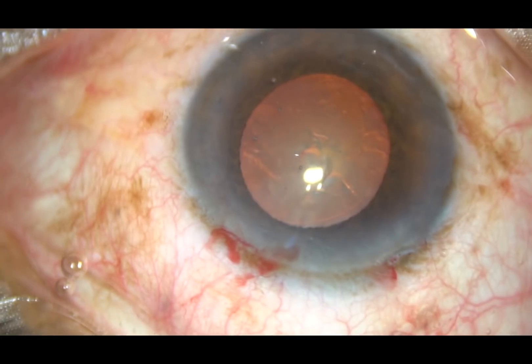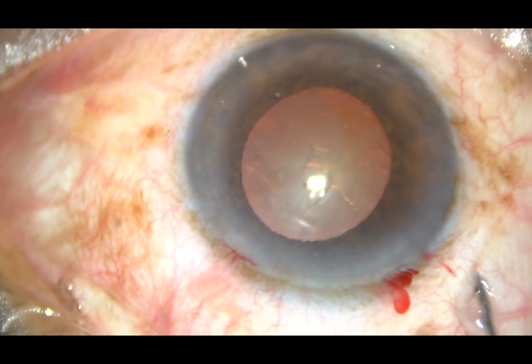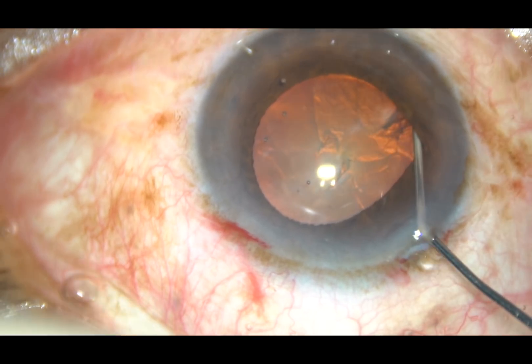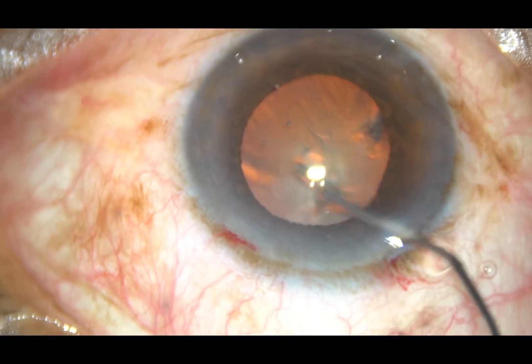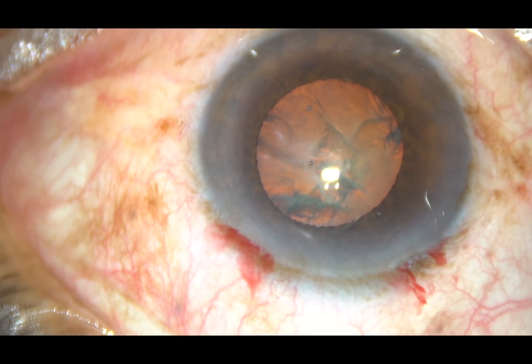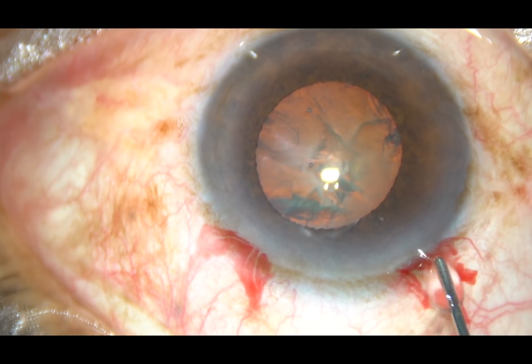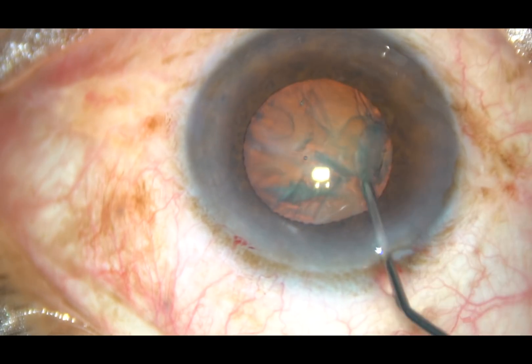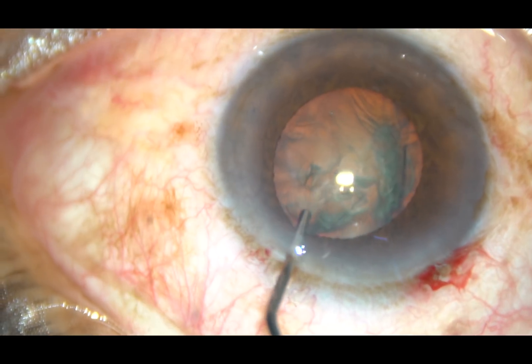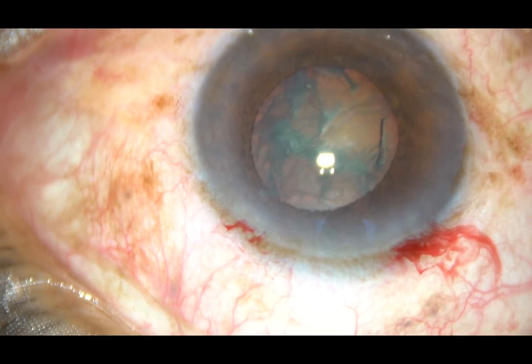Now hydrodissection. Fluid wave is passed just underneath the anterior capsular rim. This is a 27-gauge cannula and you can see the fluid wave going from one side to the other side. Some more fluid is passed from this side, and now the nucleus is free and the nucleus is rotated.